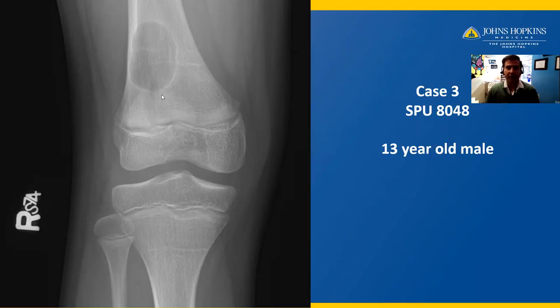You also notice that this mass is eccentric, meaning it's to the side — not in the middle of the bone. It's centered in the medullary cavity, but it's kind of scalloping the cortex. And finally, you'll notice that the patient is skeletally immature and that there's an open growth plate.